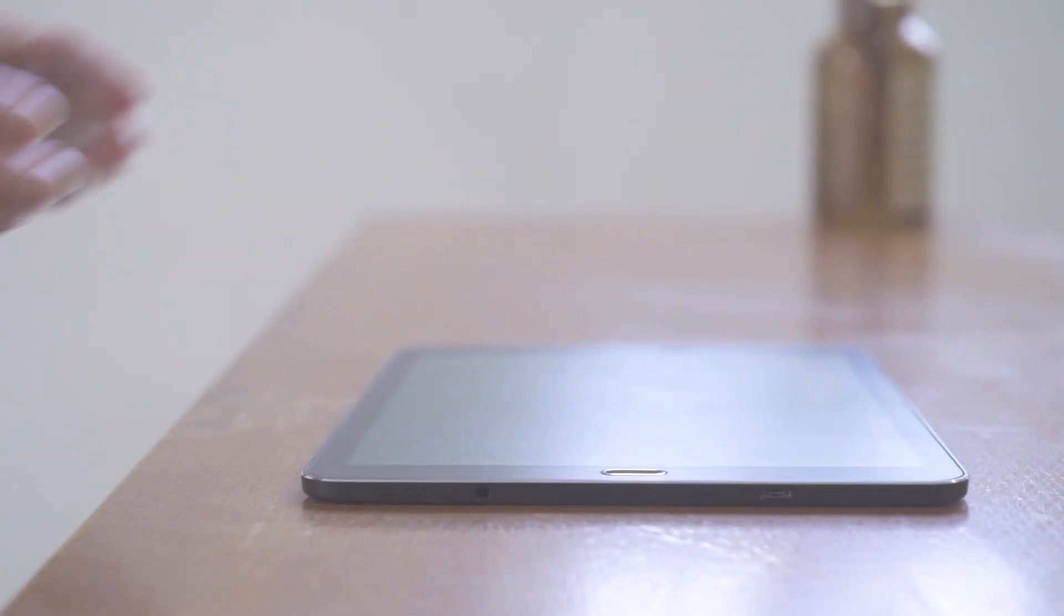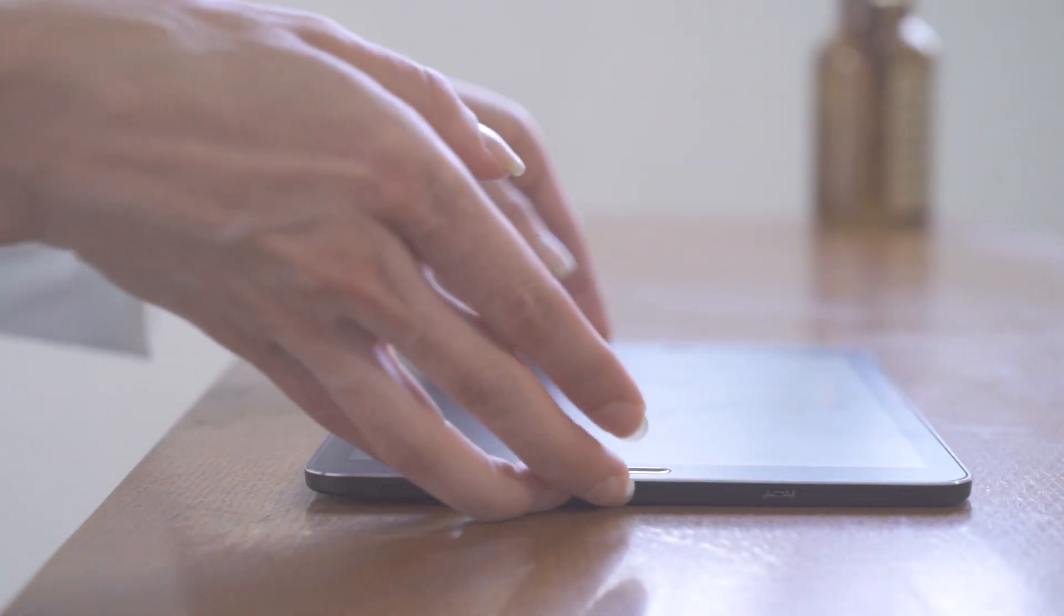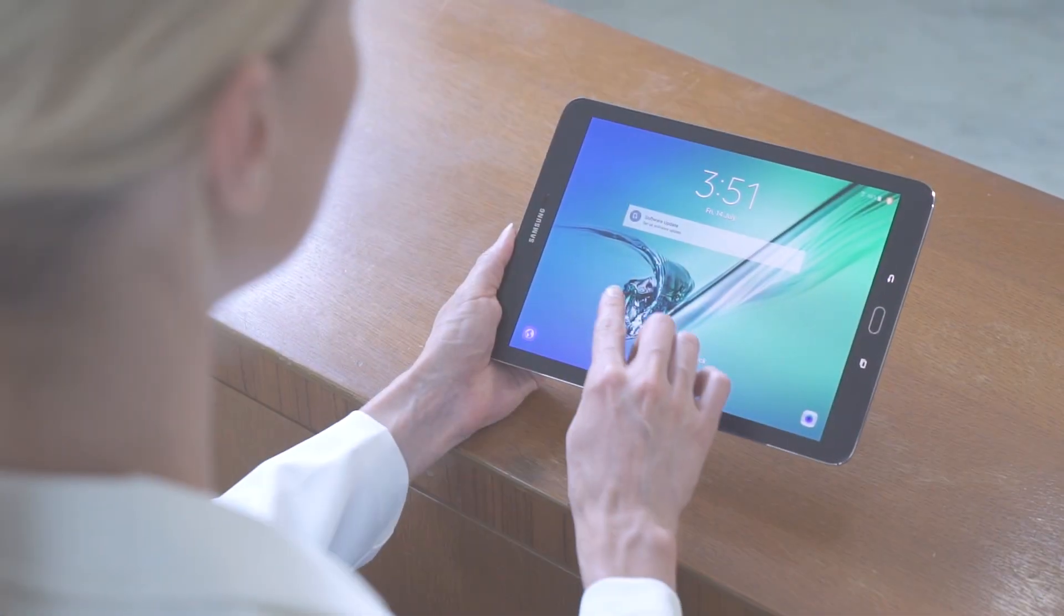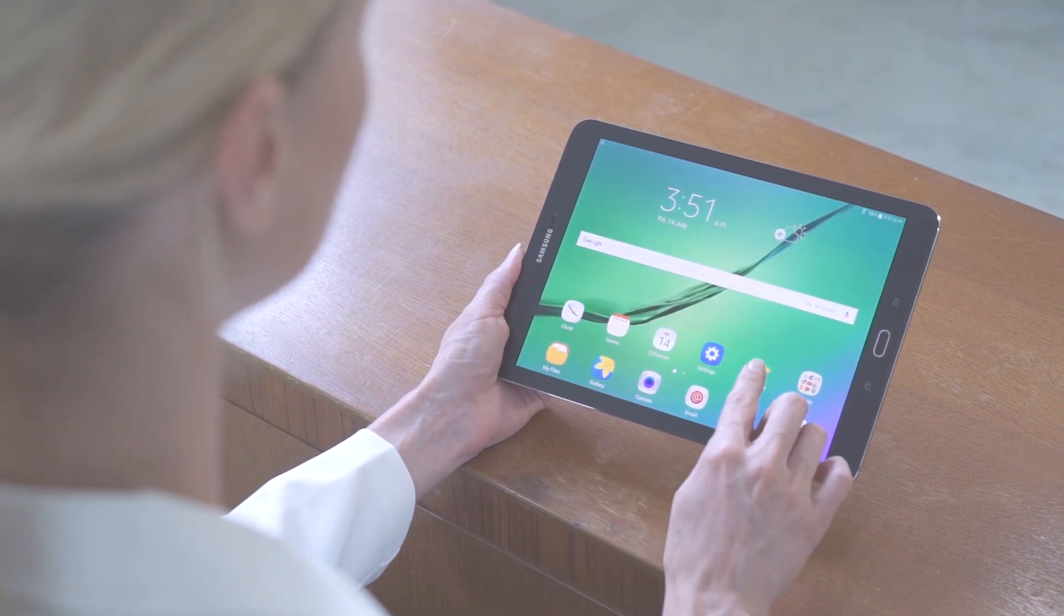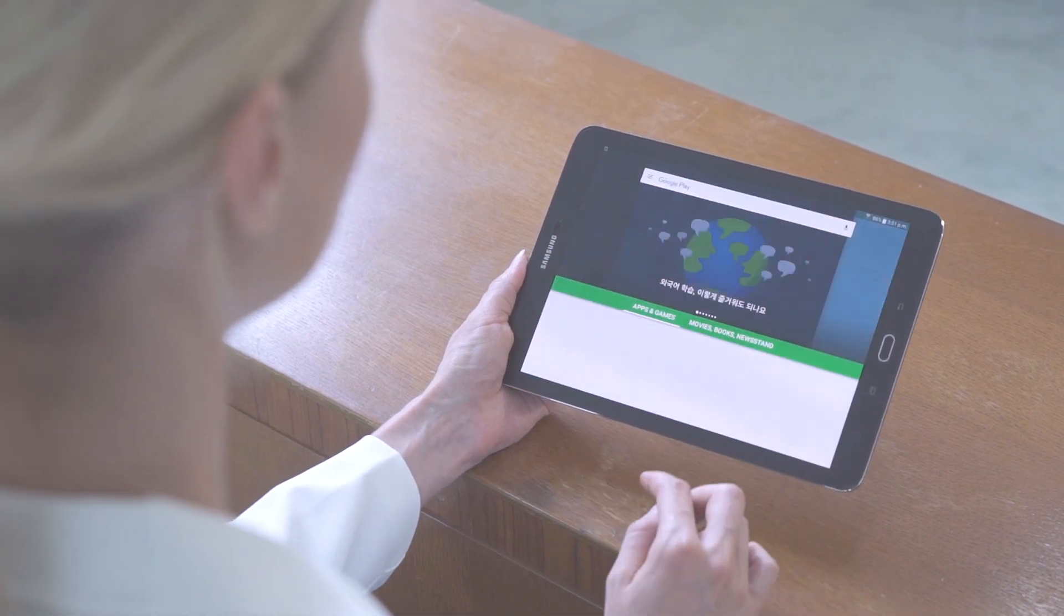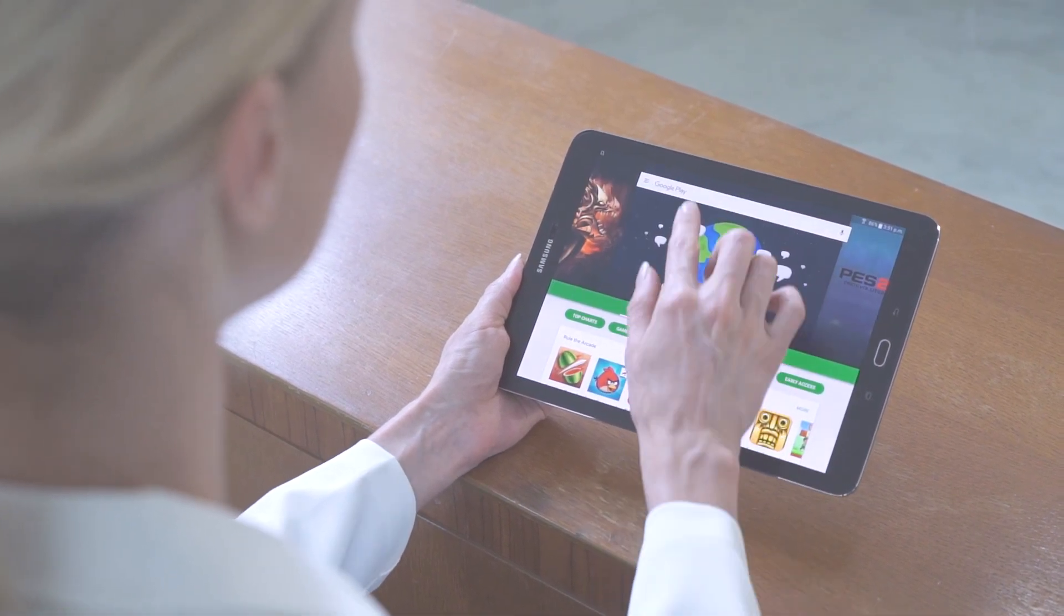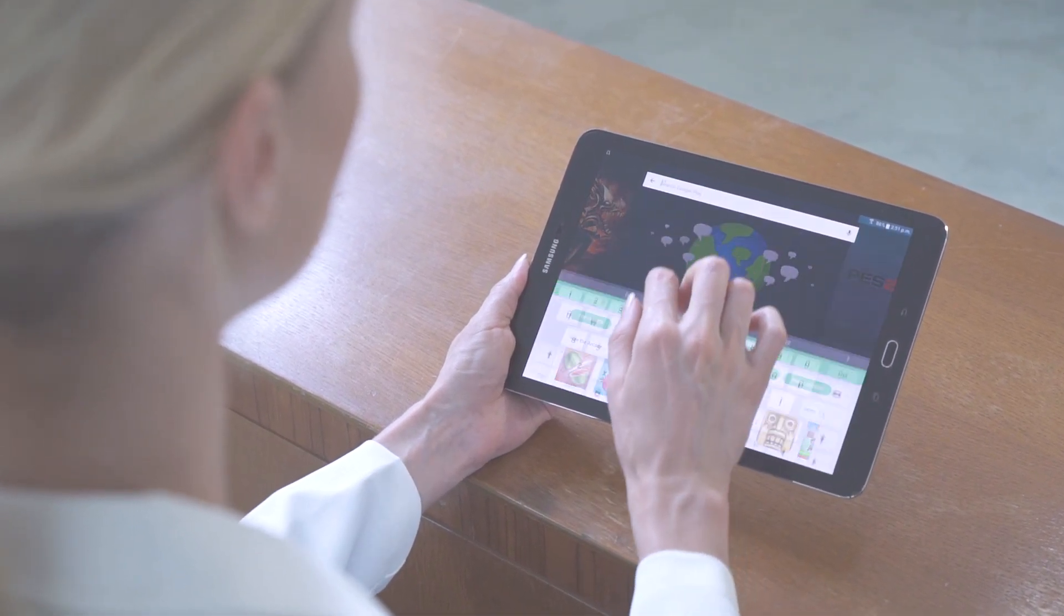So, let's see how it works. The user can easily download the application from the App Store or Google Play Store according to the type of tablet that the user is using.